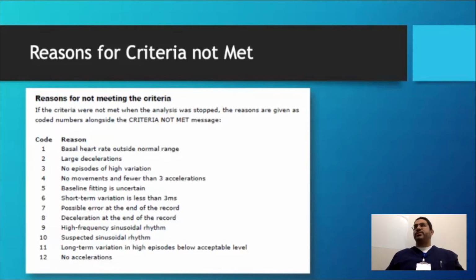They're very, very different. A baby that's always asleep is a baby that I'm always going to be worried about. A baby that I can't wake up is a baby that I'm always concerned about. A baby that's always awake, I need to figure out why. Because a baby in labor that keeps on squeezing its cord, I'm not really giving it a chance to fall asleep, am I? I am stimulating that baby's brain every time it tries to even think about falling asleep. So that baby is going to be awake all the time. Is that good or bad?